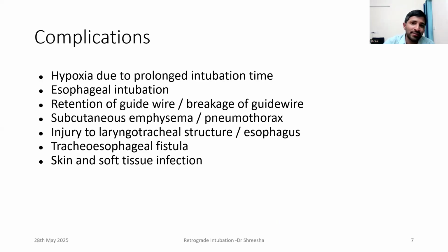However, if you are inexperienced and unfamiliar with the technique, which is a relative contraindication, this might actually take at least 2 to 3 minutes. Then if you have punctured the posterior wall of the trachea and gone through the esophagus, this can also result in an esophageal intubation. And retention of guide wire and breakage of guide wire has also been described.